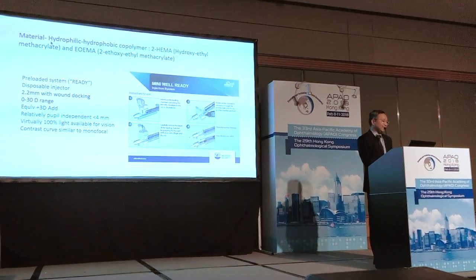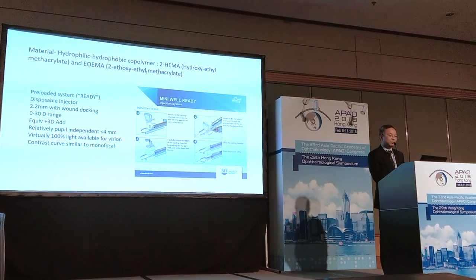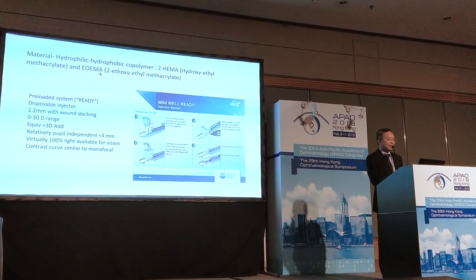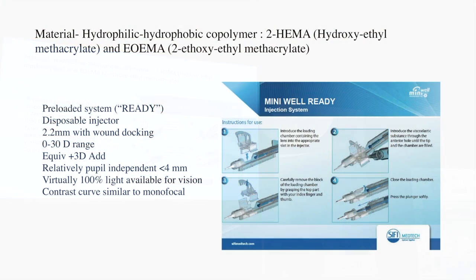The material of the lens is a hydrophobic, hydrophilic copolymer. It's 2-HEMA and 2-ethoxyethyl methacrylate, and it comes in a preloaded injector system, hence the name Ready. It's a disposable injector that will go through a 2.2 incision with wound docking. It comes in a 0 to 30 diopter range.